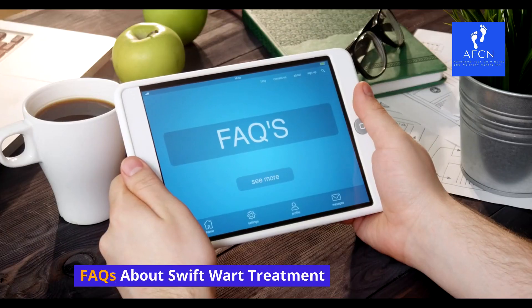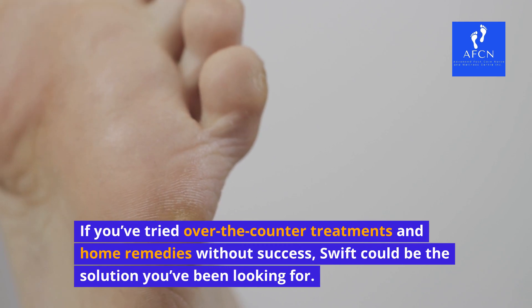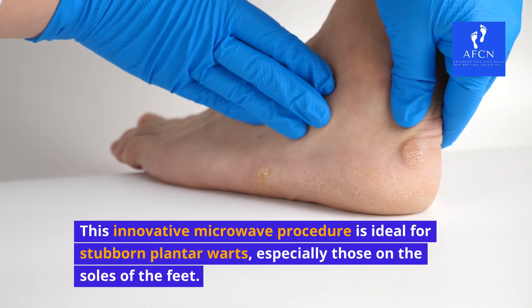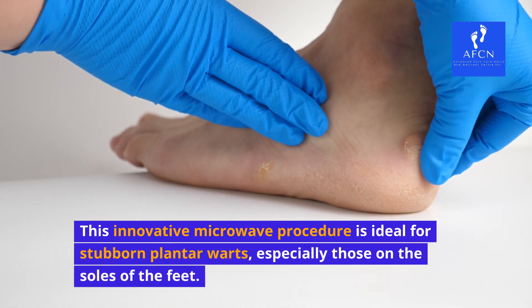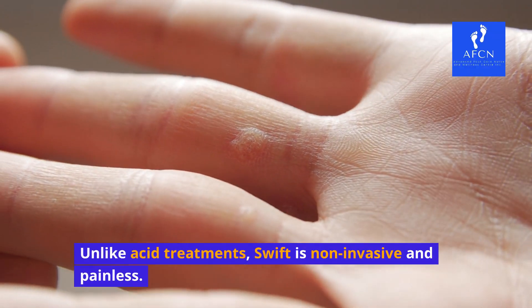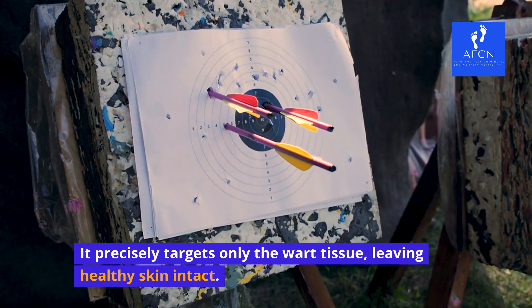FAQs about Swift wart treatment. If you've tried over-the-counter treatments and home remedies without success, Swift could be the solution you've been looking for. This innovative microwave procedure is ideal for stubborn plantar warts, especially those on the soles of the feet. Unlike acid treatments, Swift is non-invasive and painless — it precisely targets only the wart tissue, leaving healthy skin intact.